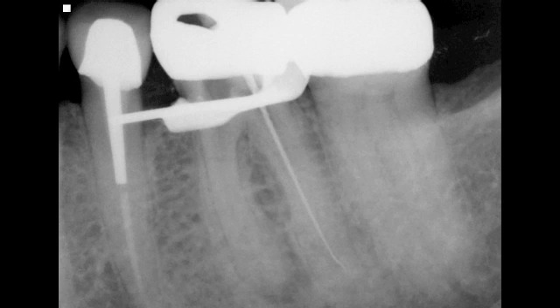Evacuating with the micro suction tip allows you to really dry the canal space, frost it, and look for any residual minute gutta percha fragments. And you can see in this case I found a middle mesial canal. The isthmuses and ramifications seem to be very well cleared.